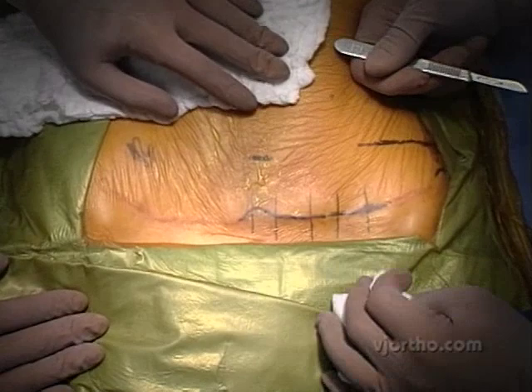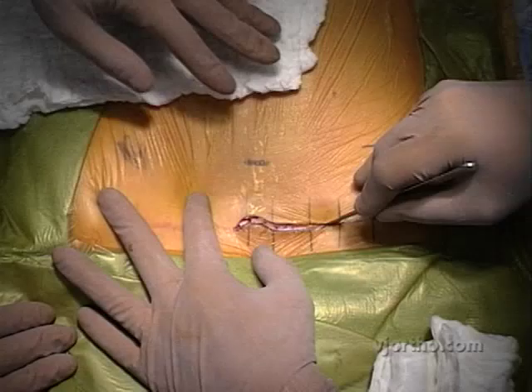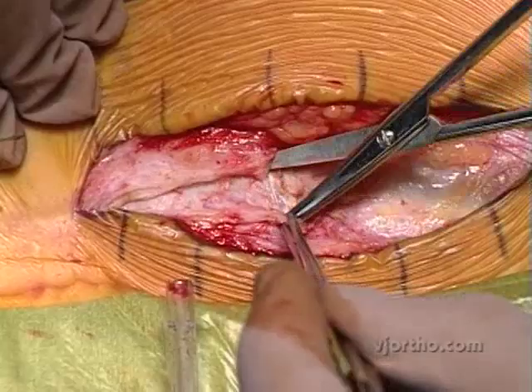It's important to note that prior abdominal surgery is not a contraindication for doing an approach for placement of a total disc replacement. The approach itself, once we make the incision, can be done either retroperitoneally, which is preferred, but if there is previous surgery, a transperitoneal approach can also be done.